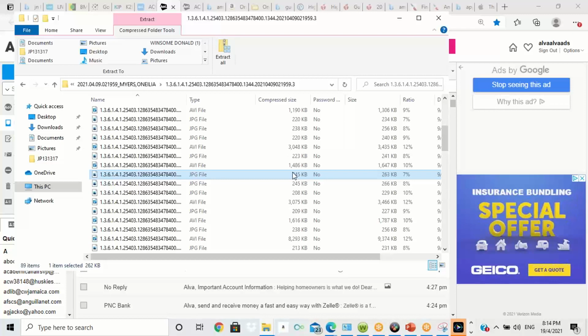So we have to wait on that. So the next set of images is going to be your pulse wave.